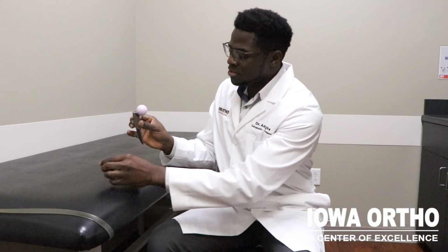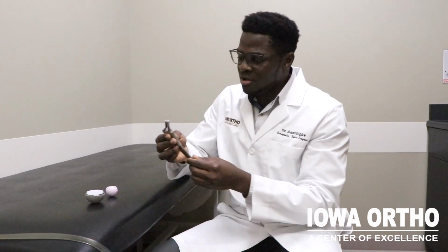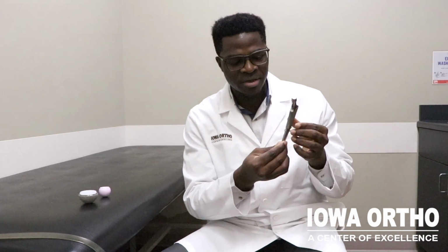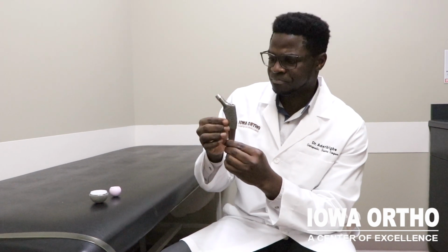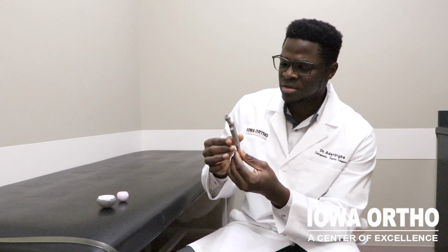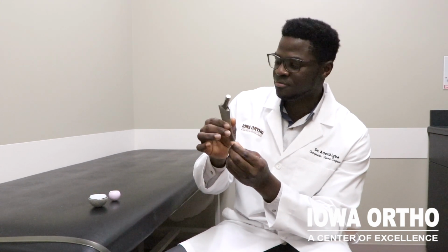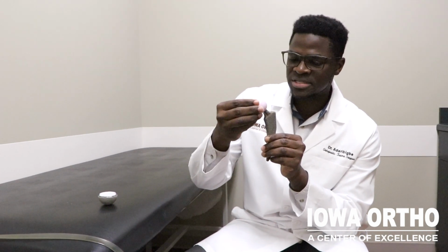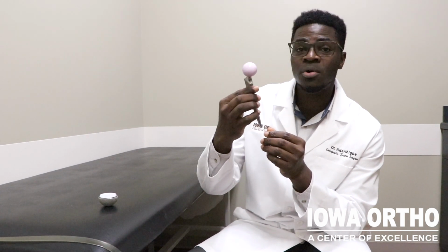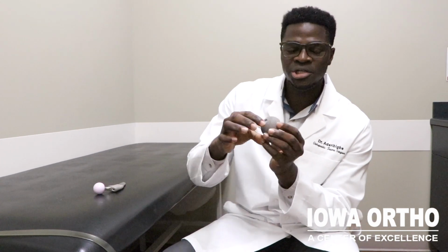These are the components of hip replacement surgery. And what we have here is a titanium stem. This is the stem that goes in the patient's femur. The stem goes in and the bone grows onto this very rough surface. Once the stem is in, there's a ceramic ball which goes on that stem, and this is the hip component itself. In terms of the hip socket, we have a shell.